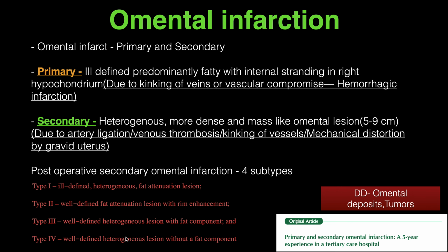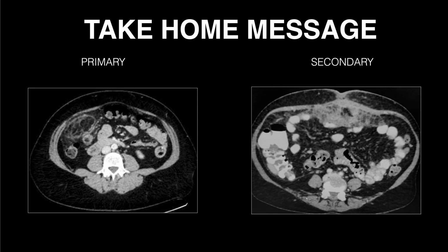So always keep in mind, sometimes an omental biopsy may be required in suspicious cases, like if it is showing mass forming, enhancing lesions within the involved area. So, take home message, here is an example.